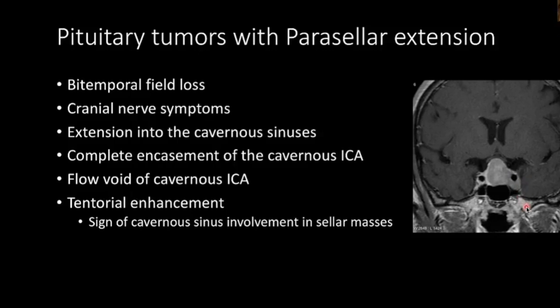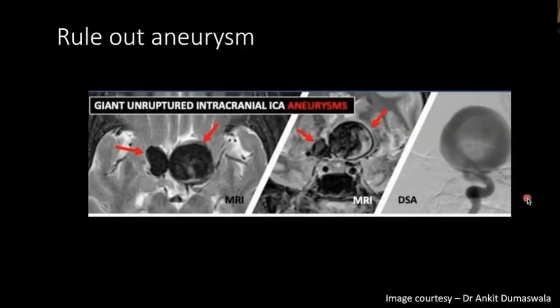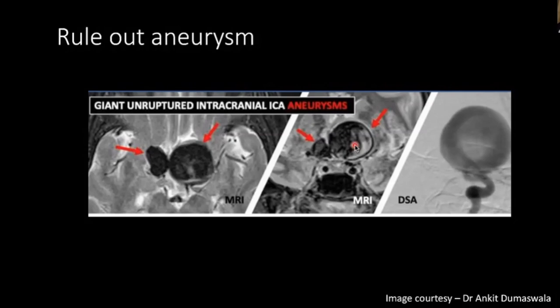Another sign is tentorial enhancement of the pituitary, visible on axial images, which indicates cavernous sinus involvement. An important differential is a suprasellar or supraclinoid ICA aneurysm, which can be mistaken for an adenoma on MRI. On non-contrast CT, the flow void may appear slightly hyperdense and be missed. Always rule out an aneurysm — missing a suprasellar aneurysm and reporting it as an adenoma would be a diagnostic disaster.